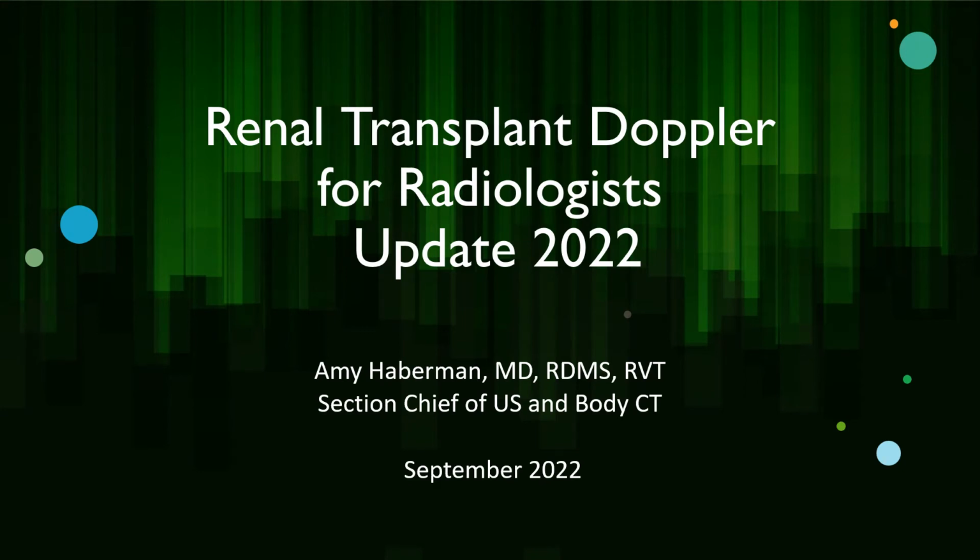I'm going to be talking about renal transplant Doppler, specifically for radiologists. The sonographers have been updated with a lot of this information. Hopefully we'll be providing you some better quality images. We'll talk about QC at the end. I just want to state that this information is explicitly for Baylor and affiliates. The images obtained here are free from Google Images, or they're images from our own studies.